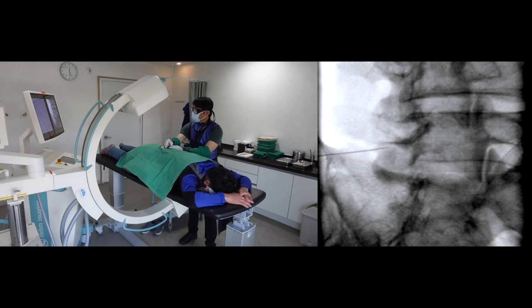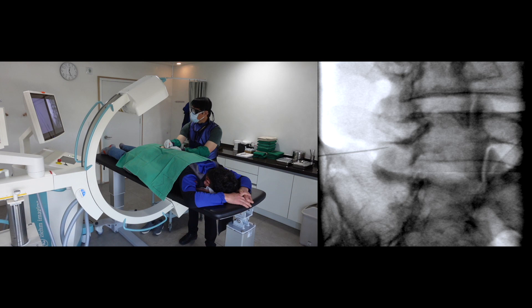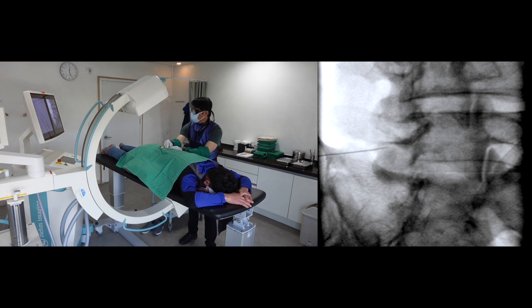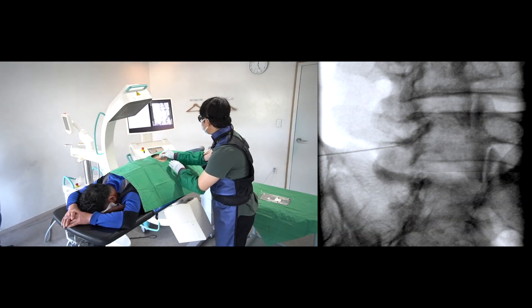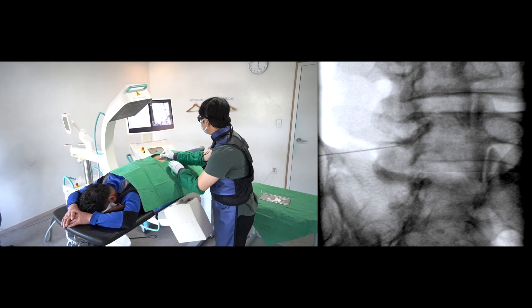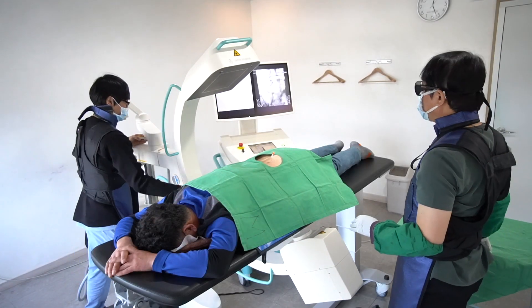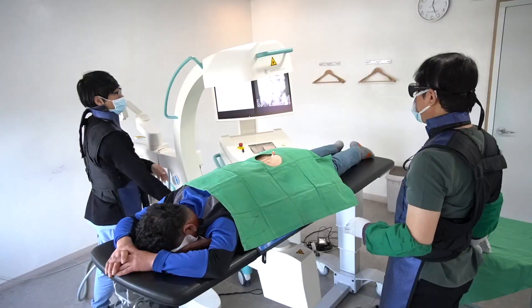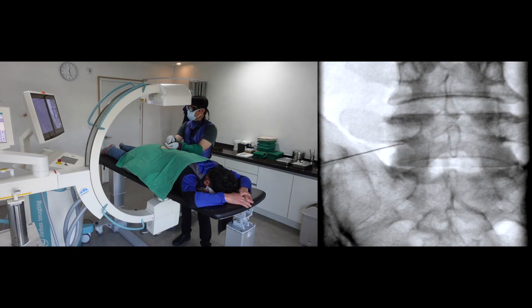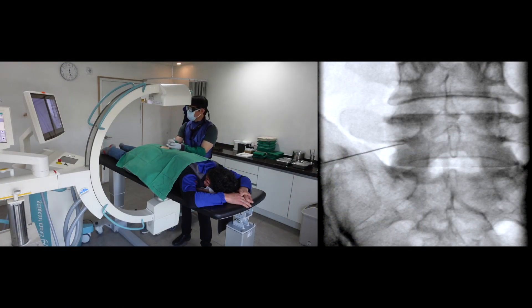I will advance the needle under the Contralateral Oblique image. Please follow the needle tip. I will return to AP view. The needle tip is correctly located in the safe triangle.